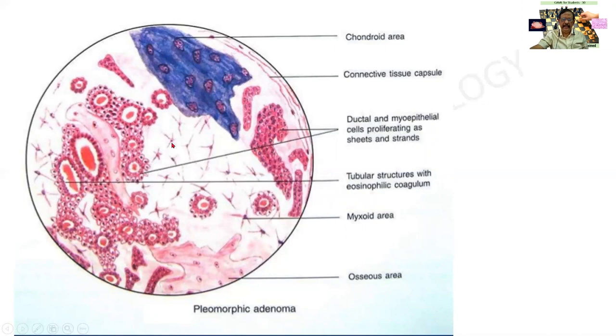As the myoepithelial cells proliferate, the stroma also becomes edematous. So these cells become separated. They lead to what is called a pseudocartilaginous appearance or a myxoid area. So please remember this. Here is a cartilage because of the bluish tinge, and here is a myxoid area with stellate cells and edematous stroma. I again repeat, epithelial cells, ductules, ducts, cartilage, and myoepithelial cells with stroma.